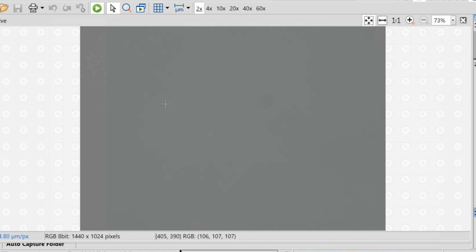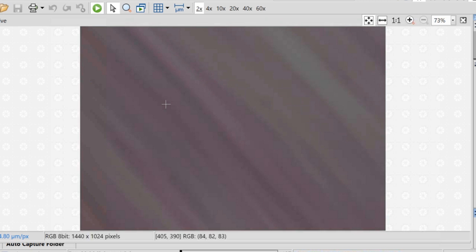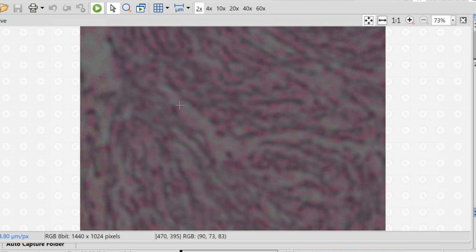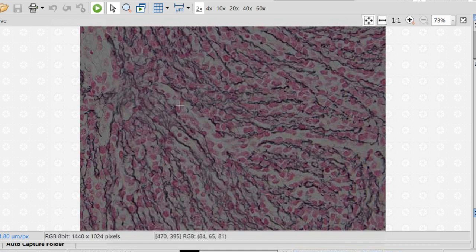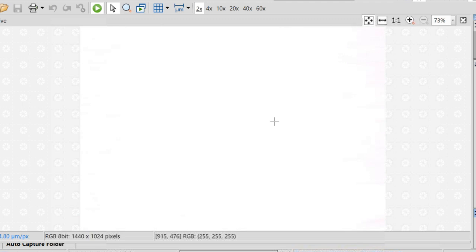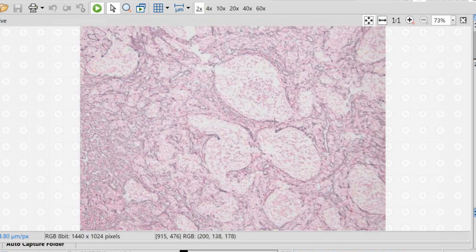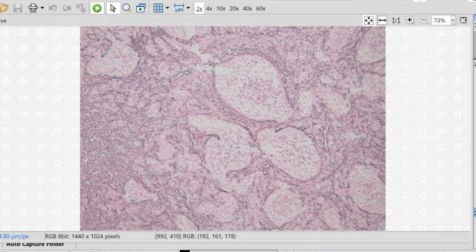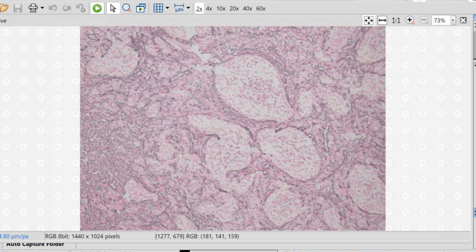A useful stain to help identify desmoplasia and nodules in subtle cases is the reticulin stain — a very old stain that has been with us for a long time. You can see heavy reticulin deposition in the internodular areas and see the nodules clearly. This is very typical of the desmoplastic nodular medulloblastoma, characterized by nodules with internodular desmoplasia. It is important to recognize this morphology because all desmoplastic nodular tumors are part of the Sonic Hedgehog activated subgroup — essentially a morphologic surrogate for this important molecular subtype.